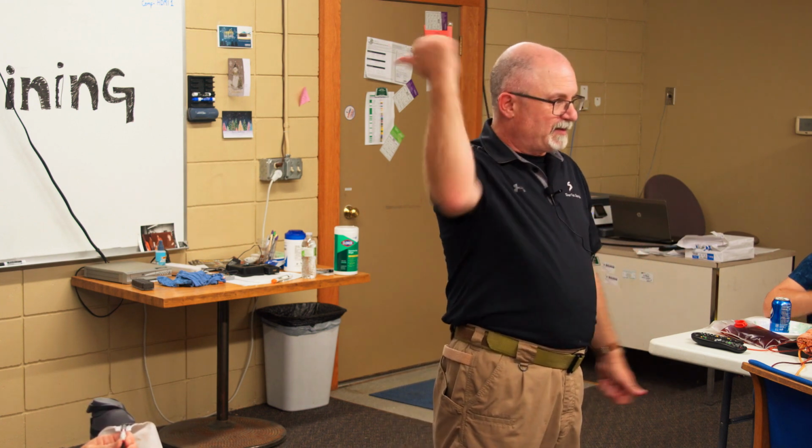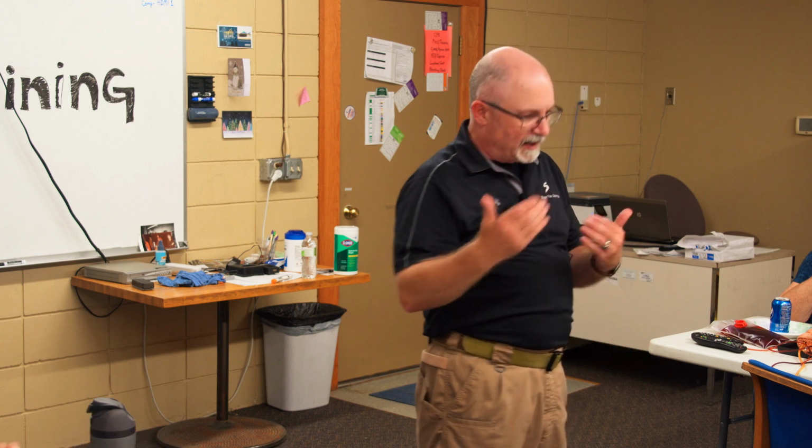So we don't just go wide open, give everybody a liter of fluid. It has to be measured. So give them a little bit. Sometimes it's give them 200, recheck them. Give them 200, recheck them. However you guys want to go down that route. That's how we ended up, and I think that's what we're kind of doing at Dodge right now too.